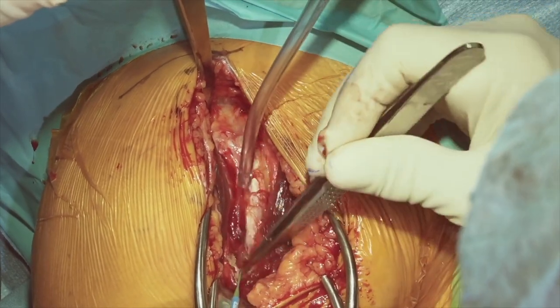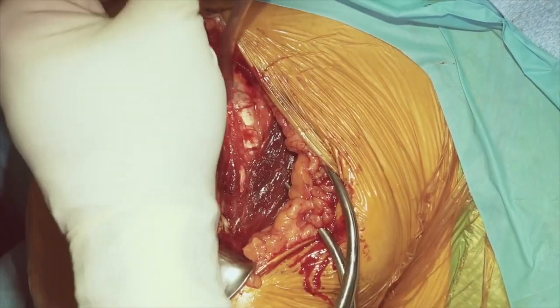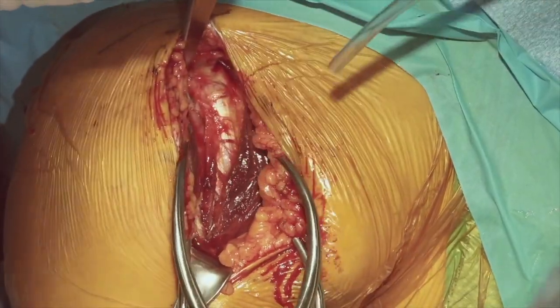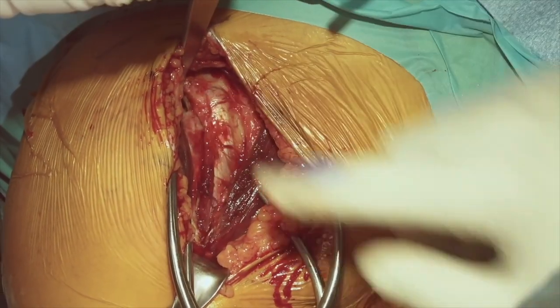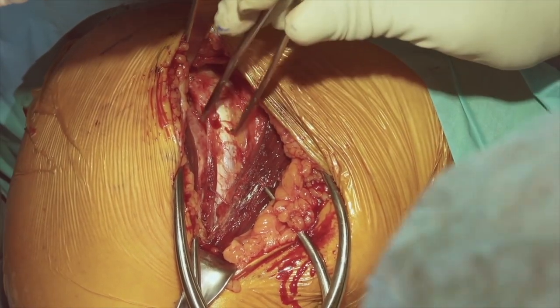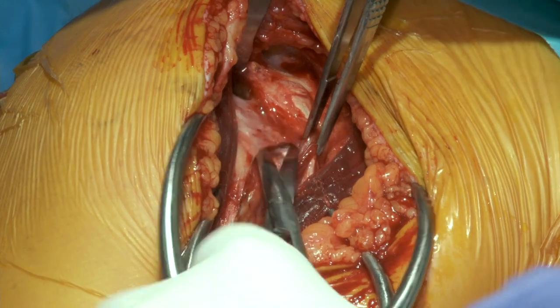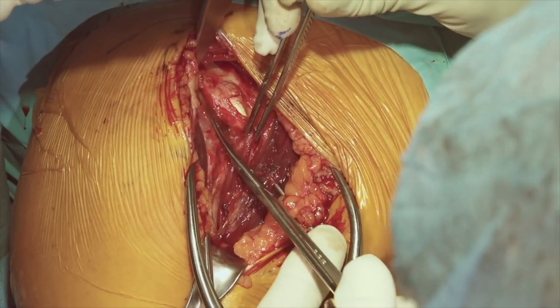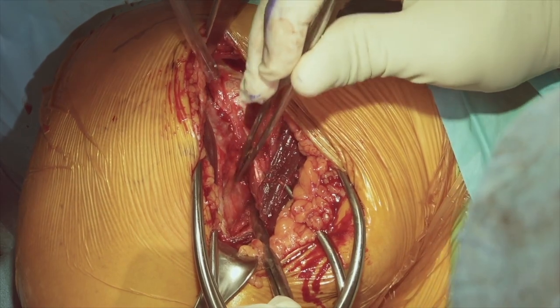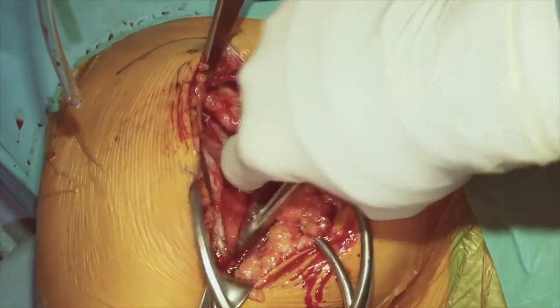Just behind us will be the long head of the biceps tendon. Once we get to the superior part of the coracoacromial ligament, we'll remove our Hohmann and put it underneath that ligament and over the top of the humerus to prepare for the exposure of the next layer. Because she has a subscapularis failure, there will be significant adhesions underneath the coracoid process. We'd like to establish our retractor in this area, opening this up safely and staying lateral to the short head of the biceps, proceeding right underneath the coracoid process.